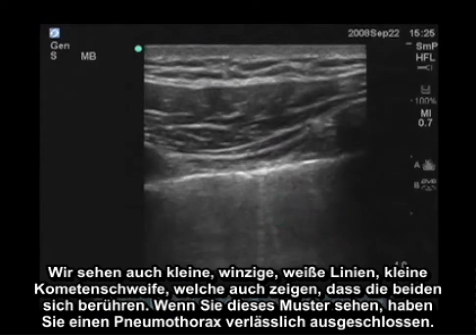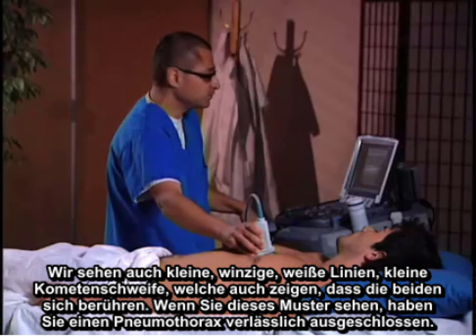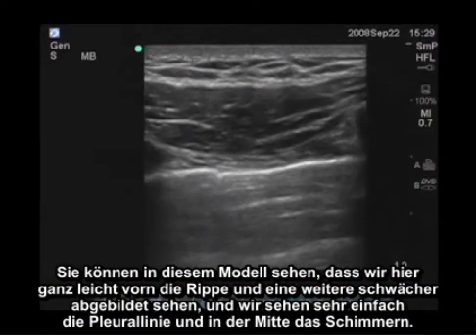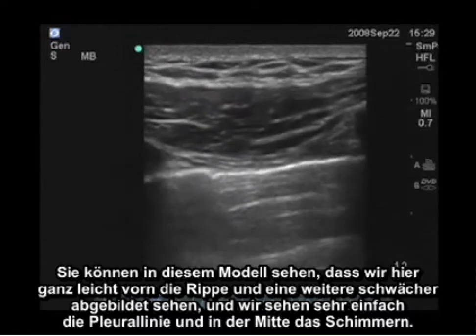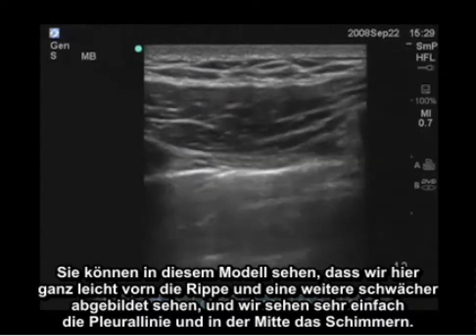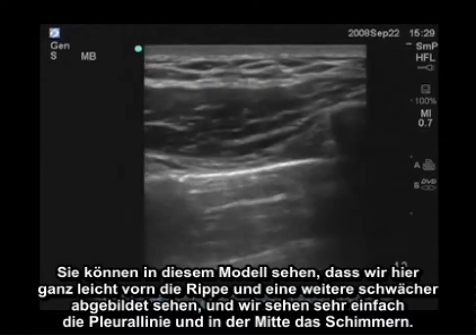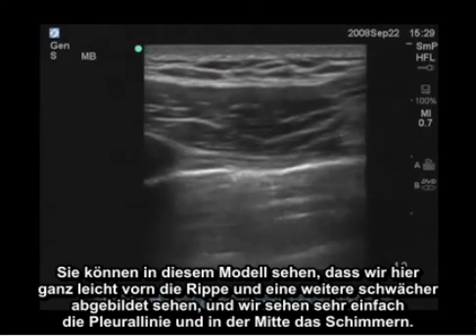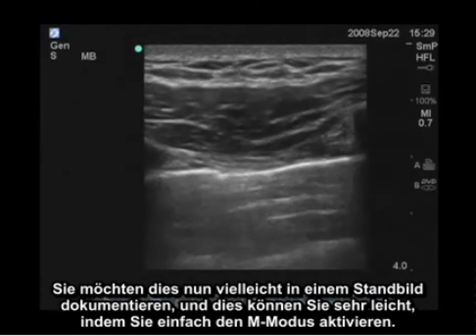If you see this pattern, you have reliably excluded a pneumothorax. You can see in this model that we can easily see the rib anteriorly and another one more inferiorly, and we see the pleural line easily in the middle with shimmering.